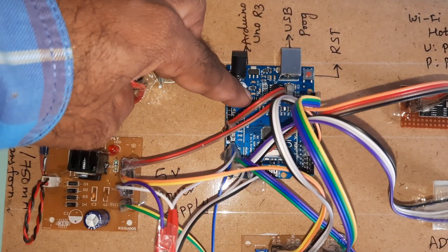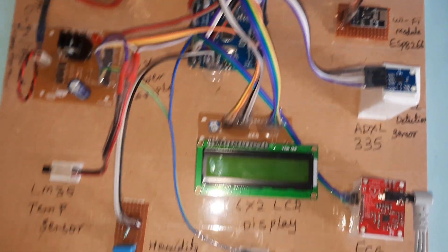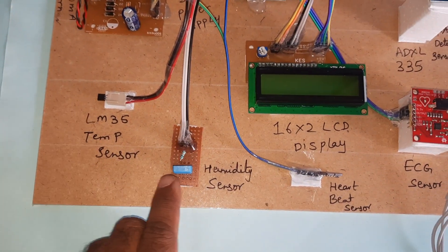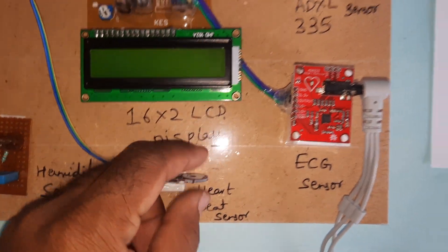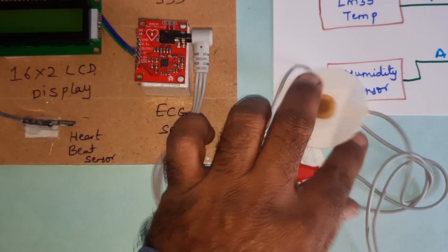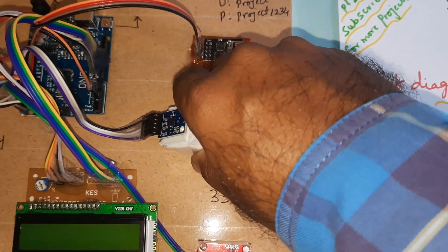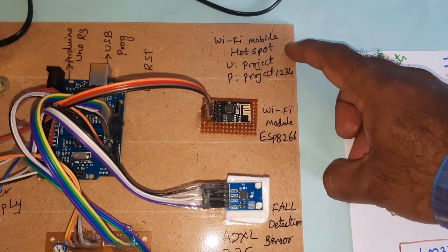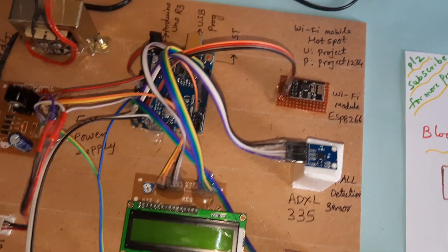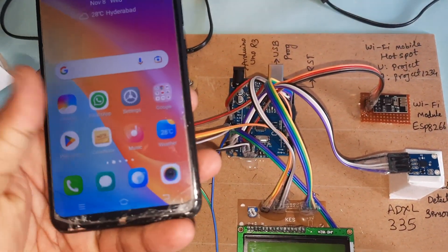The Arduino Uno R3 board has a reset button and USB programming interface. Components include the LM35 temperature sensor, humidity sensor, heartbeat sensor module, ECG module, fall detection sensor, and the WiFi ESP8266, which requires a WiFi hotspot internet connection.